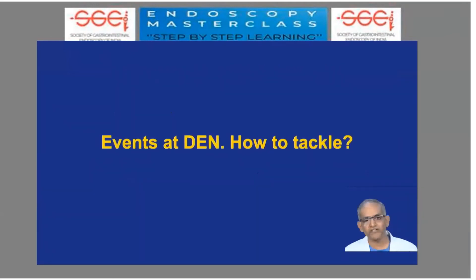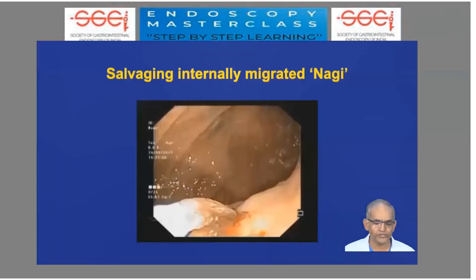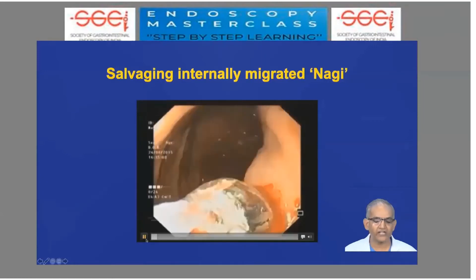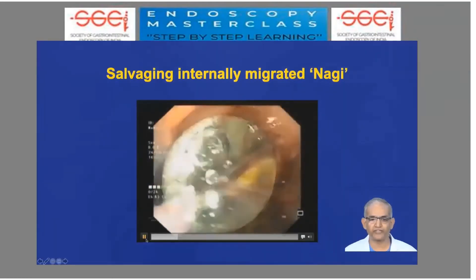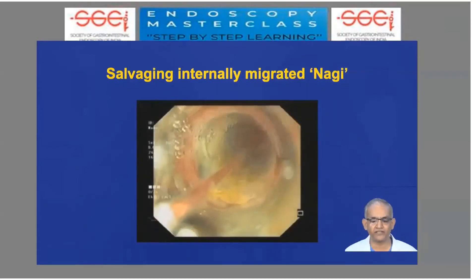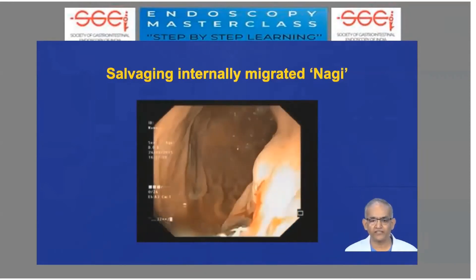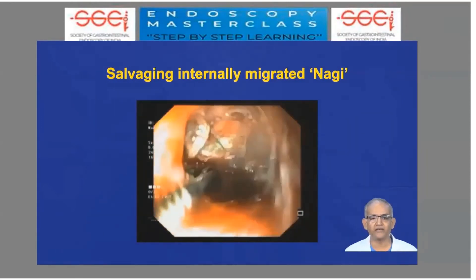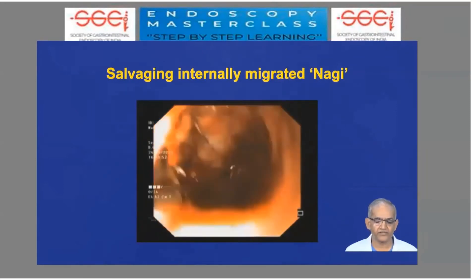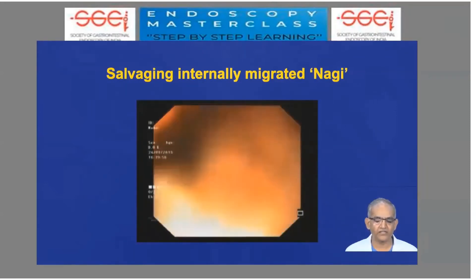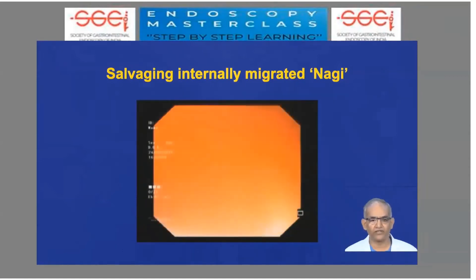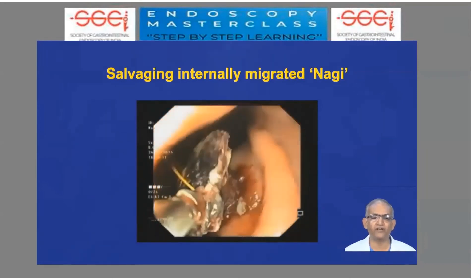Some unexpected events can happen and here is how to tackle them. This shows a stent that had migrated inside during a previous session of necrosectomy — when we came for the second session, the stent had migrated internally. We had to dilate the fistula opening with a balloon, then gently catch the stent with the edge and tease it out. You can always reposition the stent back to its original intended position — that's internal migration.